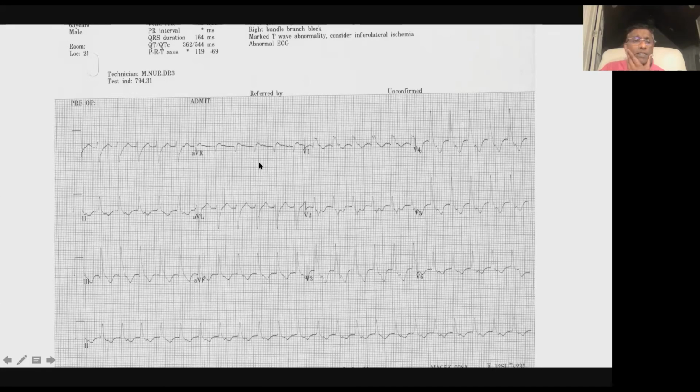So I want to walk back a little bit. You started out saying it looks largely narrow, and that's something to watch out for. Look in all leads before you decide whether it's narrow or wide. And I agree with you that looking down here, it looks pretty narrow.